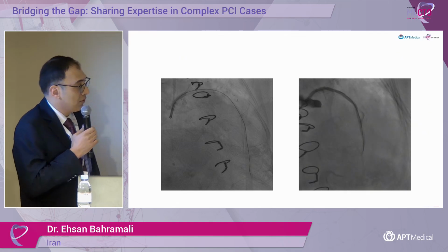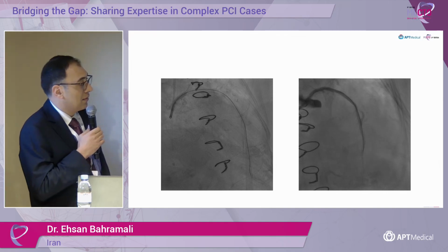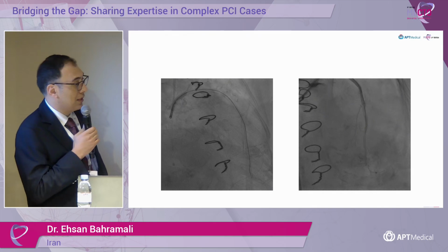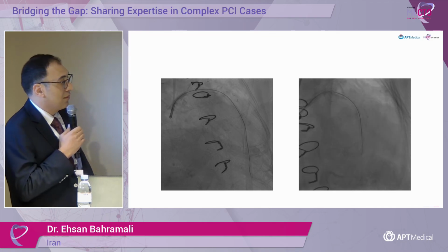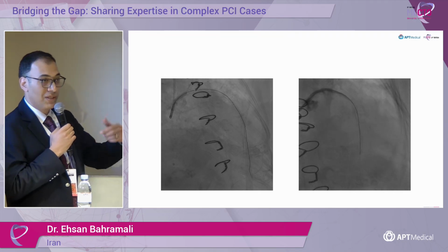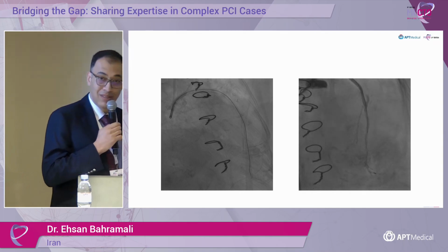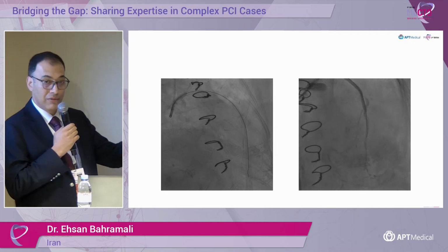And the interesting thing was we had no problem with the patient's hemodynamics during the first 2 hours of the procedure. But after the LAD was open and we had put the first stent, whenever the guiding catheter sat deep in the left main, we had a damped pressure and a reduced blood flow. We couldn't comprehend what the reason was, and it persisted during the last hour of the procedure.